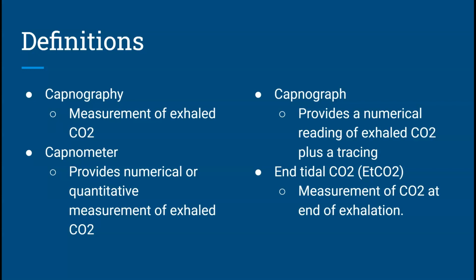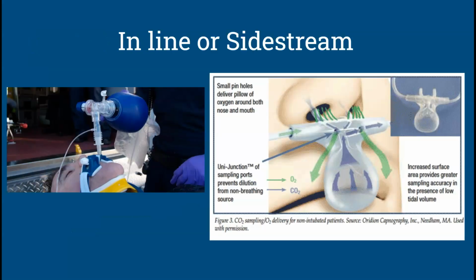Maybe they have a history of asthma and they've gone into respiratory failure, and you go and you check and they've got this shark fin vibe, and you're like, oh, let me see if I can send albuterol, or maybe I can give them epi, right, to help fix the air trapping situation that's going on in their lungs. So there's a lot of information that capnography can give to you that will help you guide your treatment for the patient.